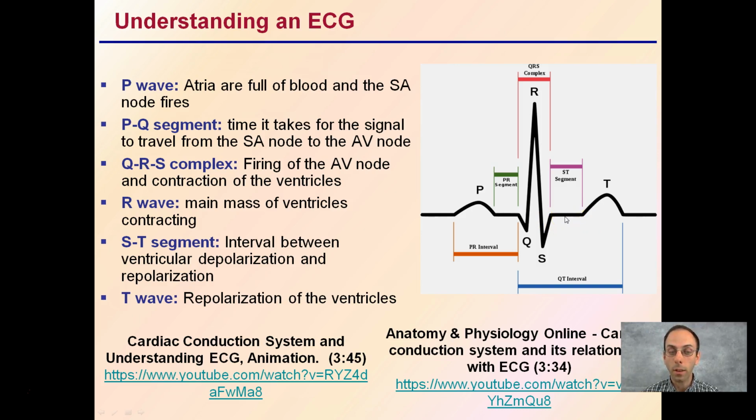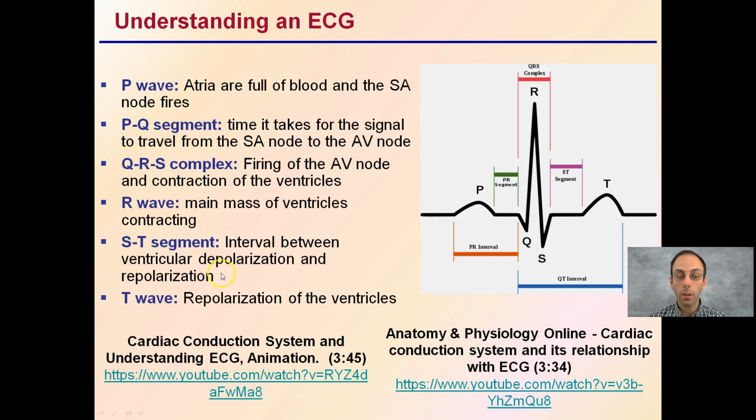There's a little bit of a delay process, leading to the T wave, which is the repolarization of the ventricles. We see a slight increase there. In addition to the description I'm giving you, there's also a couple other videos here that you're welcome to look at.